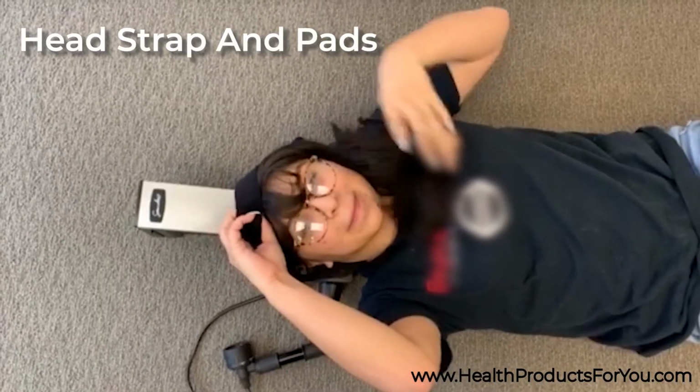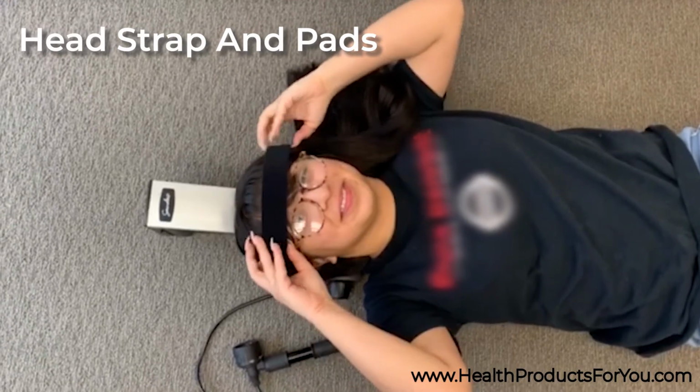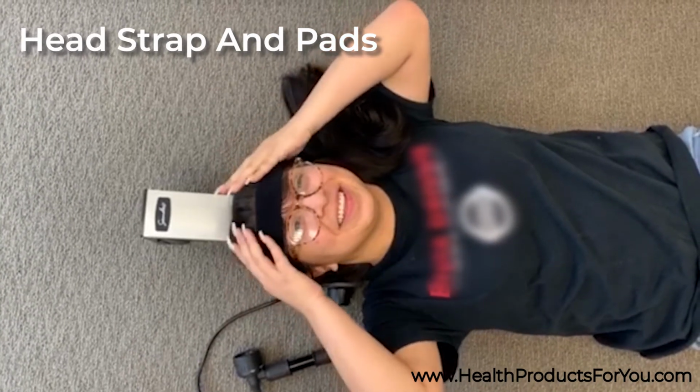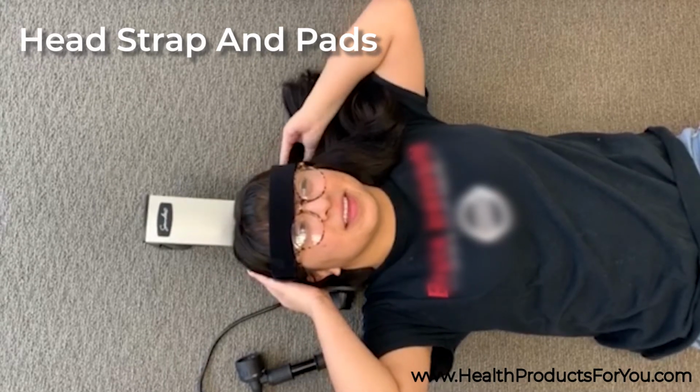Head strap and pads. Next, lie down on your back, positioning your body so the neck wedges cradle the middle part of your neck and your head rests comfortably on the head pad. Make sure to secure the head strap over your forehead just above the brow line. This strap should fit snugly.